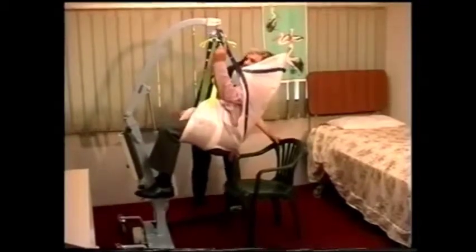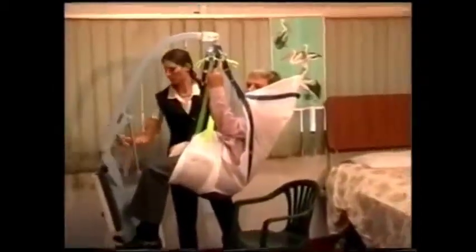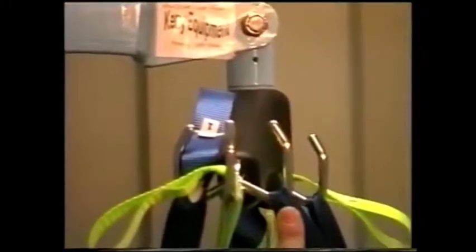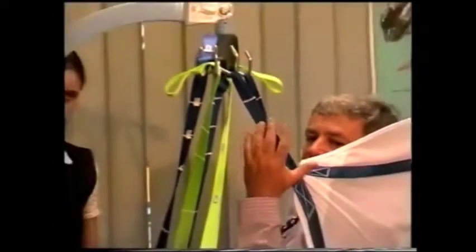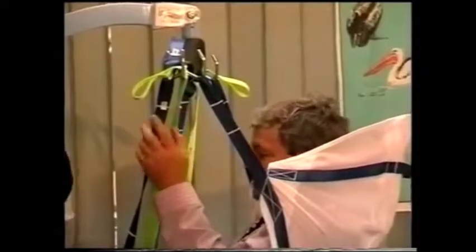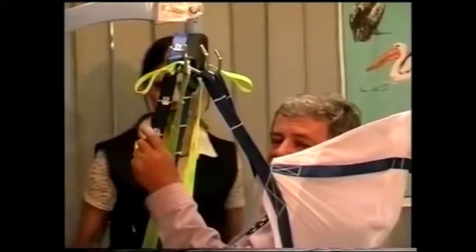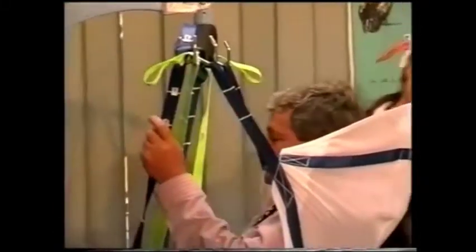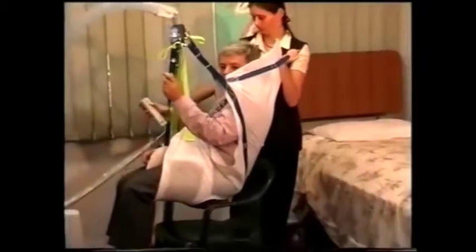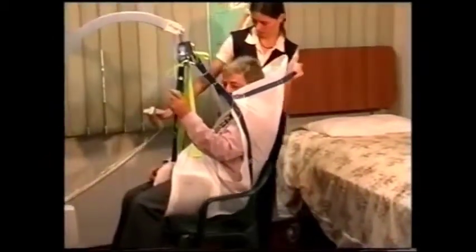Right, so that's using the first loop on the hooks here. Can you go in on that, James? The very first loop as opposed to the second or the third loop down. The closer you are to the sling, the more upright the person will be sitting. Okay? Now this time, can you show Vicky who's going to have to hold the straps as I go down? Rightio.